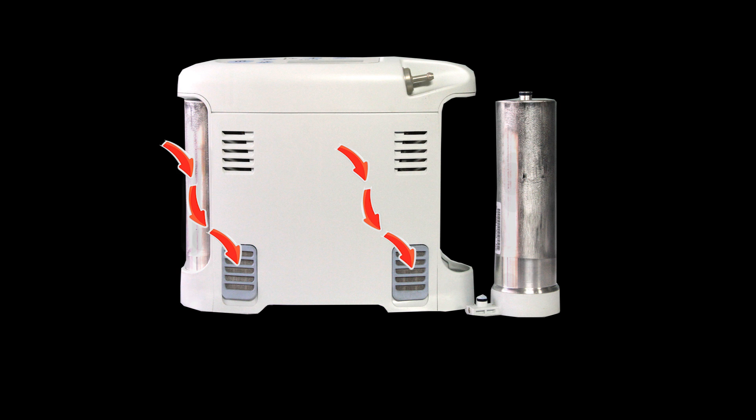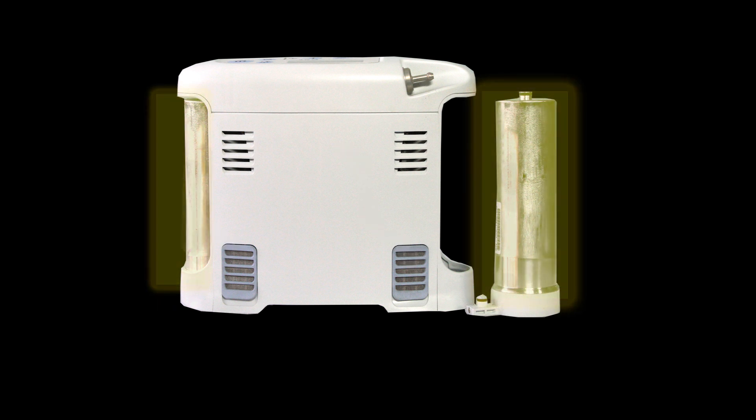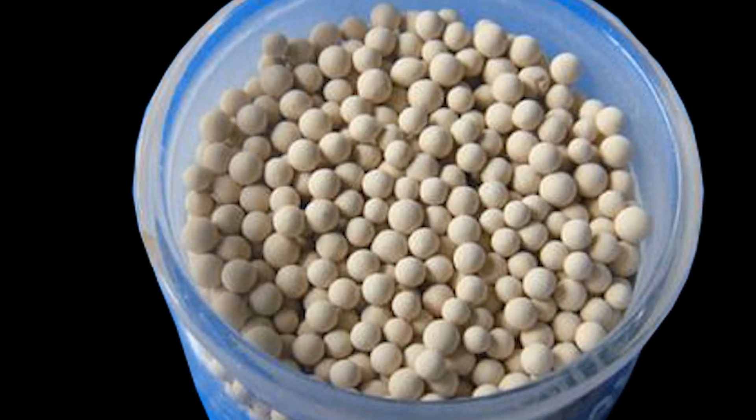The compressor motor draws in air through the concentrator's particulate filters. These filters prevent dust, pet hair, and other particulates from entering the concentrator. The filtered air is then drawn into the sieve beds — in this particular concentrator, the sieve beds are the metal cylinders on either side.